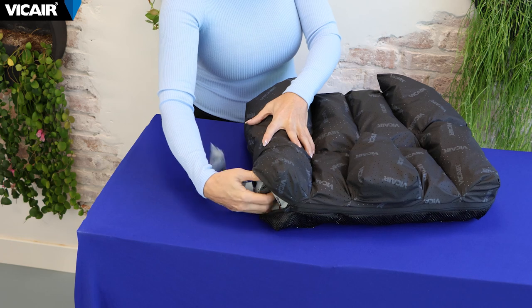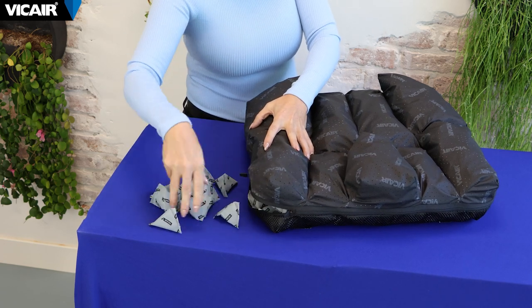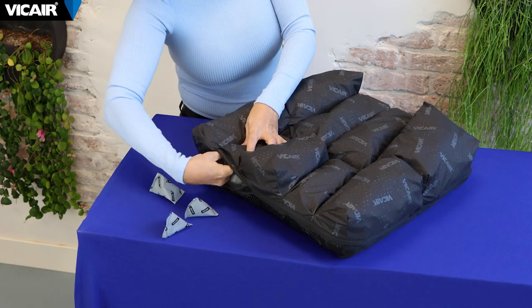Then we work toward the front of the cushion so the femur can extend, allowing the heel on the non-affected side to reach the floor in front of the wheelchair. In order to lower the femur down for touching the ground with the heel, we remove 10 smart cells from the front side compartment and five smart cells from the compartment below the femur.